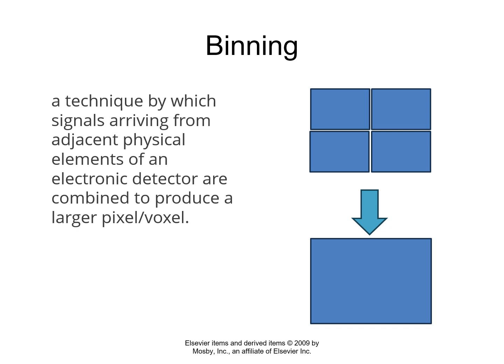And so what this does is it effectively divides the number of pixels that you have to read by 4, okay? So if you have 1,000 by 1,000, that's 1,000,000 pixels divided by 4. Now it's only 250,000 pixels. And so now we can read them out even faster because we bundled those adjacent pixels and the charges that they captured together into one pile, one stack, okay?